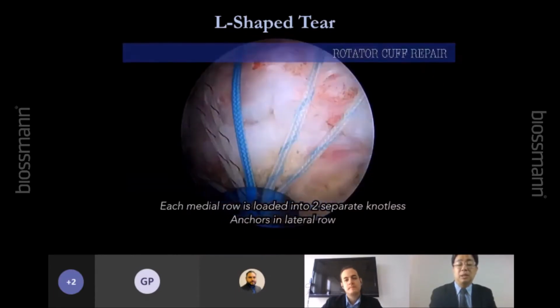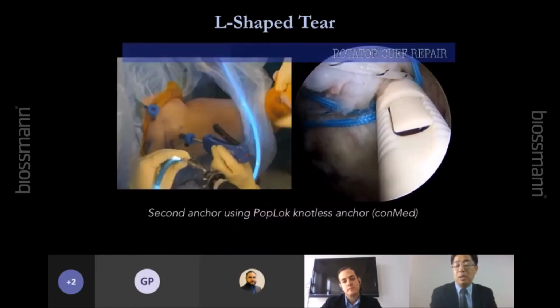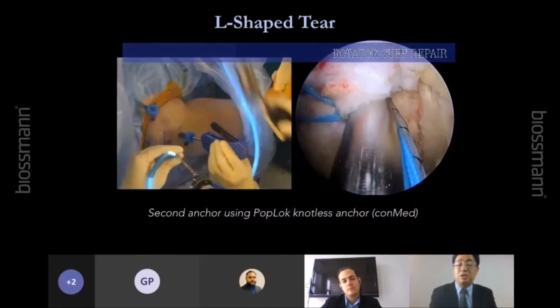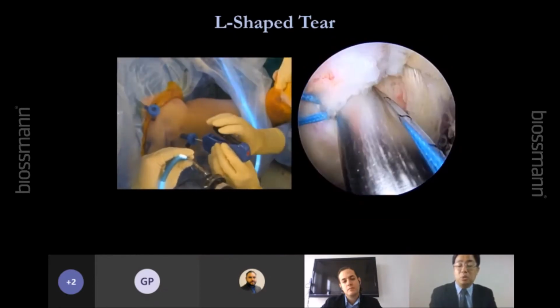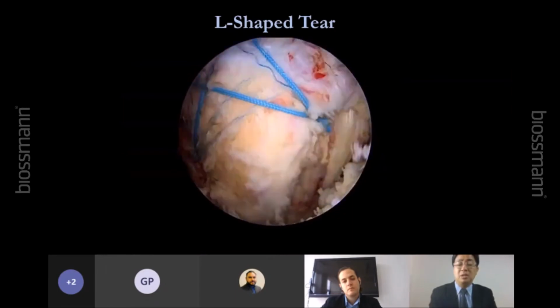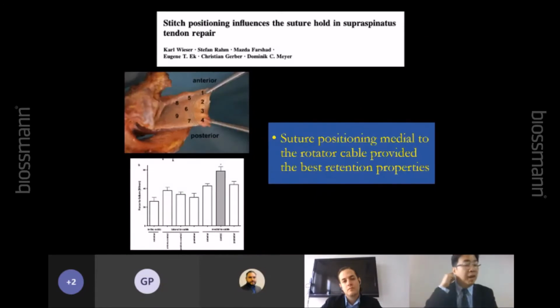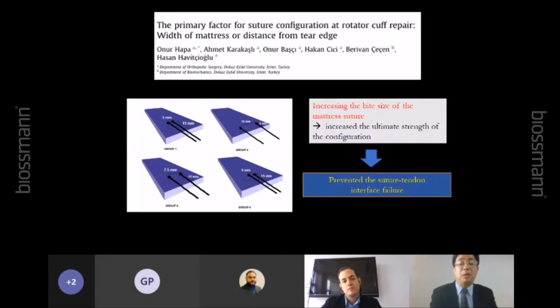Okay, and then I try to put my lateral row as wide as possible. One in the bicipital groove, another one close to the infraspinatus insertion. Okay, in this area the bone quality is quite good, from the study. Okay, so this is the L-shaped tear, right? From this study, we found that if you put the suture too close to the rim, it's not good. You should put it more proximal, close to the rotator cable. And the distance between each hole is also important, right? 5 millimeters is too close. If you tie the knot, you can cut through the tissue. So my distance is about 7 to 8 millimeters, right?